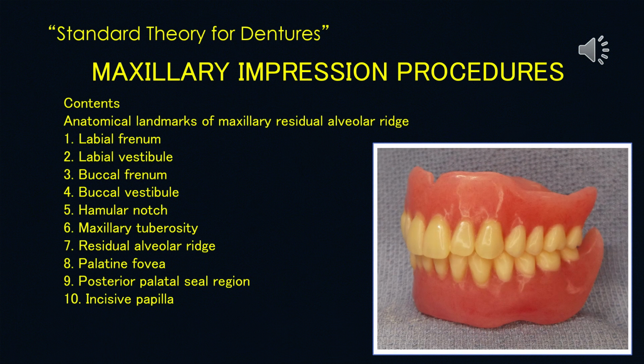Standard Theory for Dentures. I am Sotokawa, a dentist practicing in Morioka City, Japan. This topic covers the maxillary impression procedures.